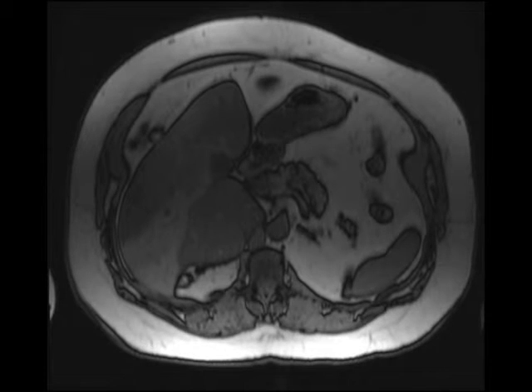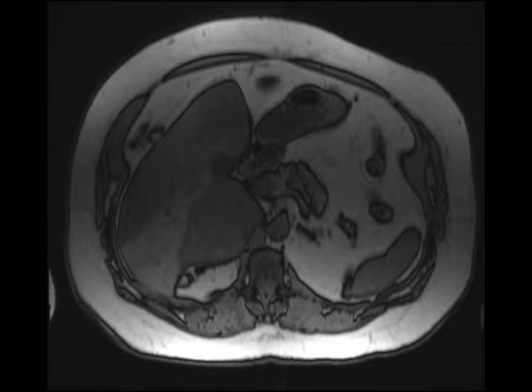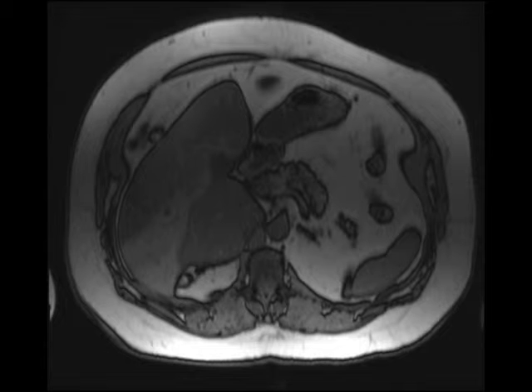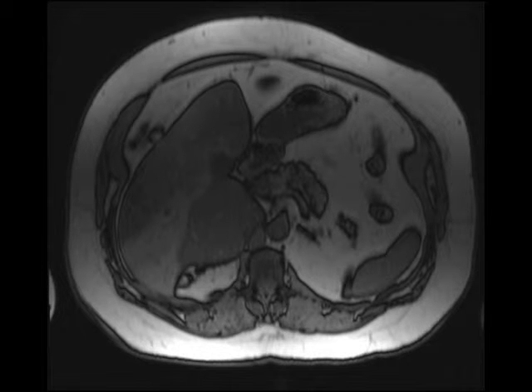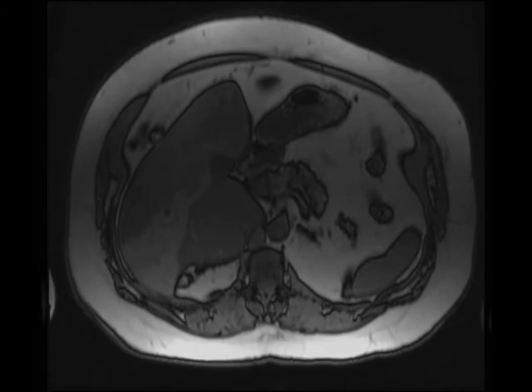Notice that the mass demonstrates no appreciable signal dropout on the out-of-phase images when comparing the in- and out-of-phase gradient echo images. The mass does demonstrate some heterogeneous enhancement, including some arterial hypervascularity on the post-gadolinium images.